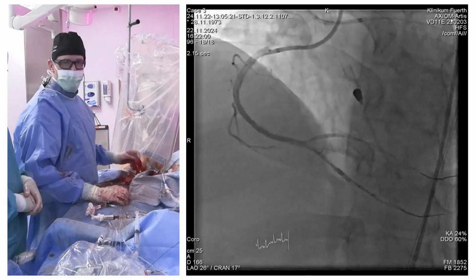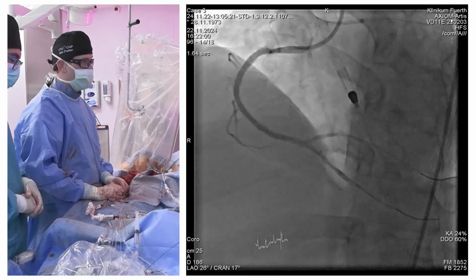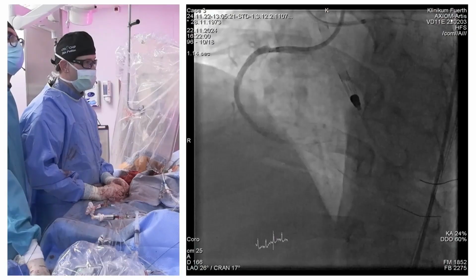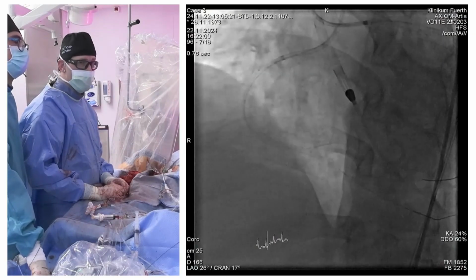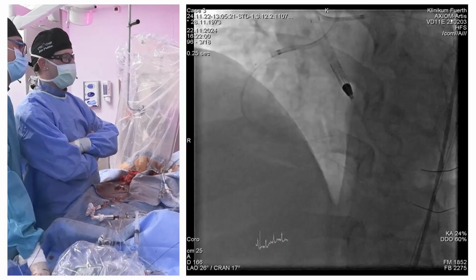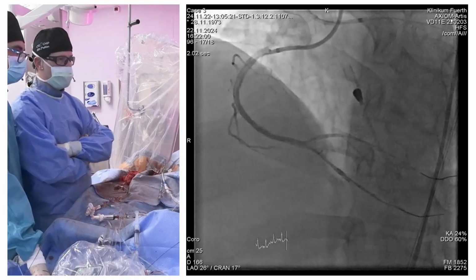Yeah, sure. May I put one really provocative thing, because you asked about the DCBs. In the past, many years ago, we used perfusion balloons, and now I didn't even see them on shelves. I guess that if you really want to elute the vessel wall with drug, we would use a drug-eluting perfusion balloon, because then you can leave it for 5, 10, or even 30 minutes.